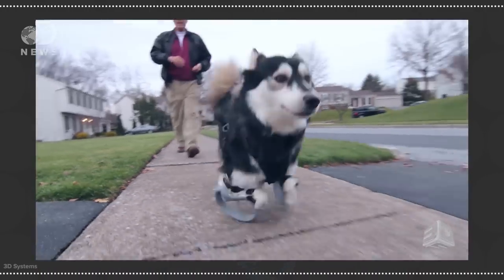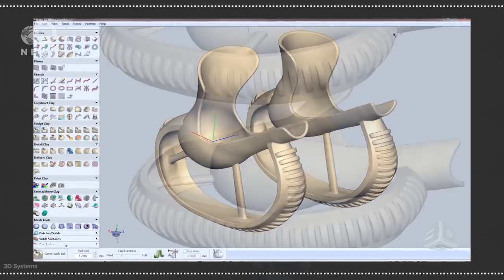3D Systems, a company based out of South Carolina, designed artificial legs for Derby, but unlike a cart system, these prosthetics are designed for running. They look a lot like the blades Paralympic athletes might wear. Now this lucky dog can frolic through the grass with the best of them.